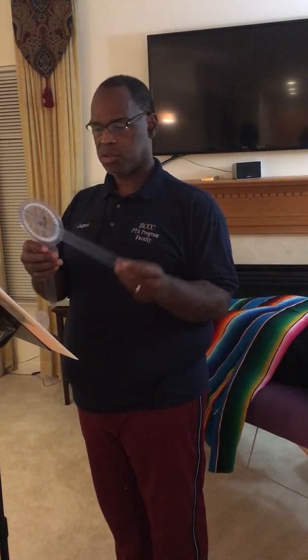If we're going to be measuring those motions, of course, we need to put the goniometer in a 90-degree angle, reading the red scale if we have a red scale goniometer, or doing a subtraction or an addition with that goniometer number if that's the case.